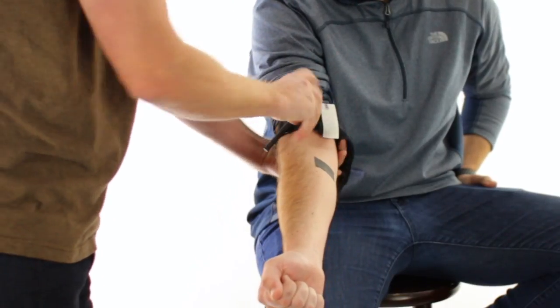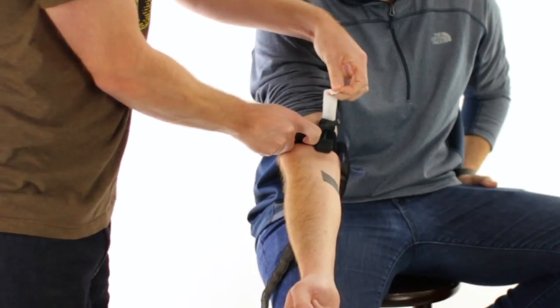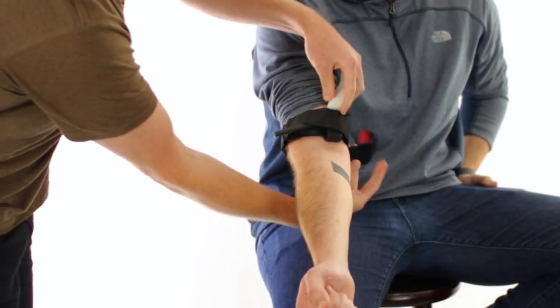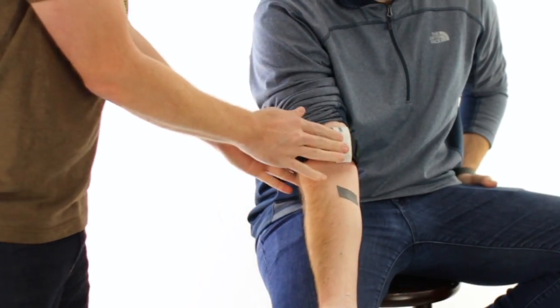Take out all of the slack, turn the rod until the bleeding stops, lock it in place, wrap the excess band, and write the time.